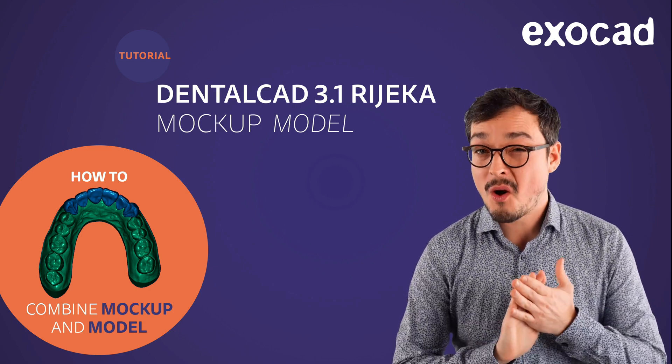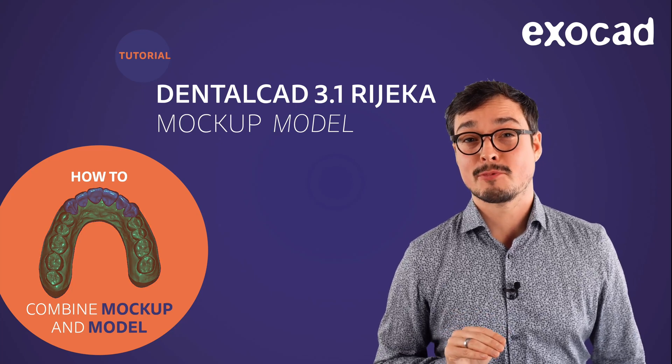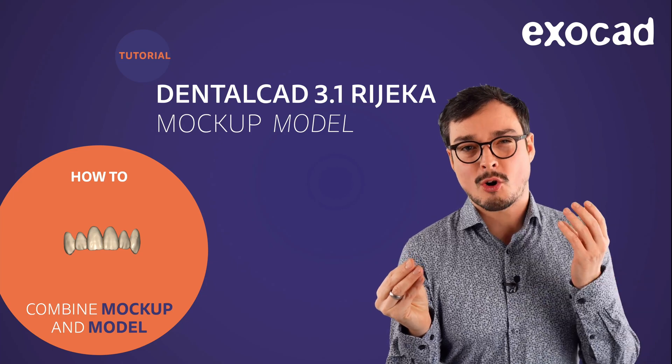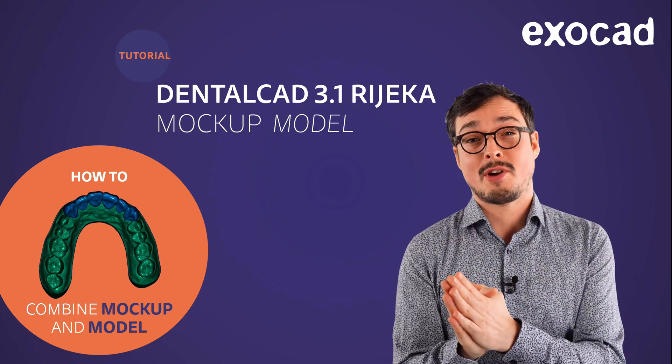Hello, I'm Clemens from Exocad. Welcome to this video tutorial. Today, you will learn how to create a digital mockup model for 3D printing. To do this, we merge the digital design and the original model into just one watertight mesh. All you need is our Dental CAD and the model creator module.